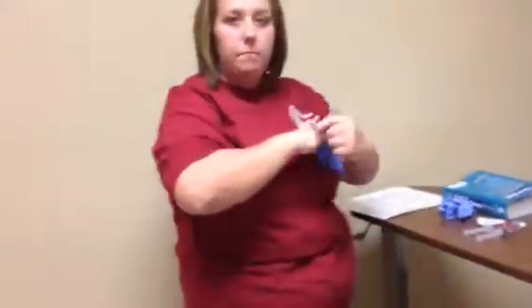Alright, Mr. Dunn, have you ever had any Demerol before? And they tell you whether or not they've had some. So you want to tell them what to expect, because remember, IV medications are going to take effect immediately. So kind of tell him what he's going to expect.